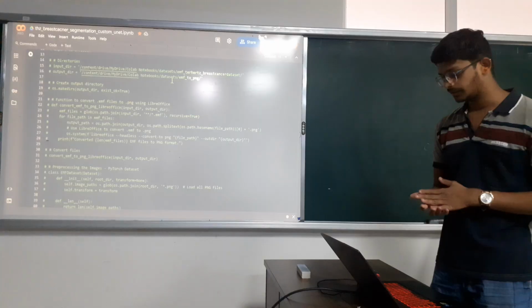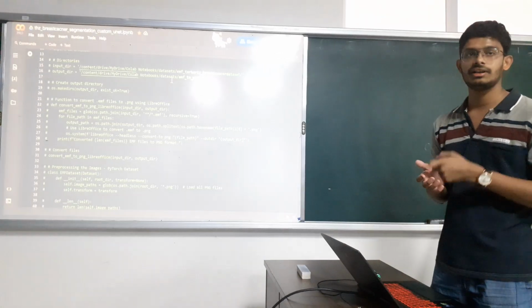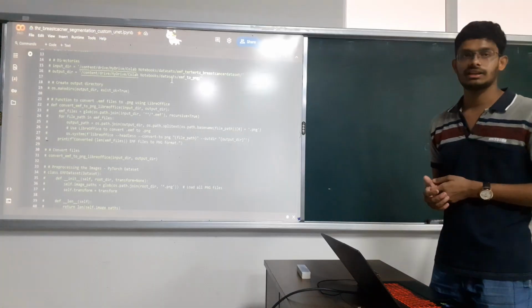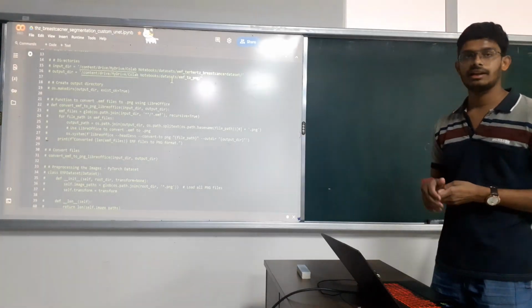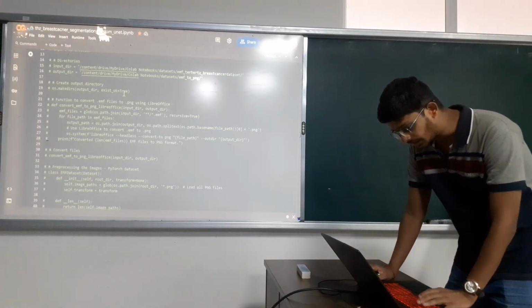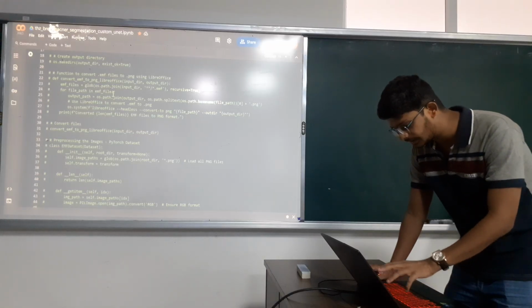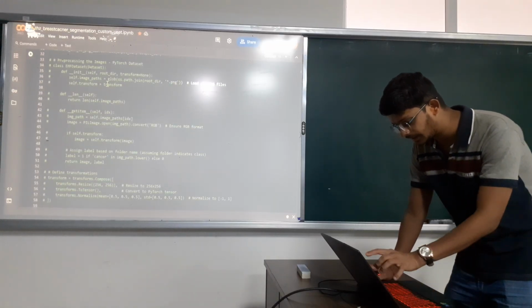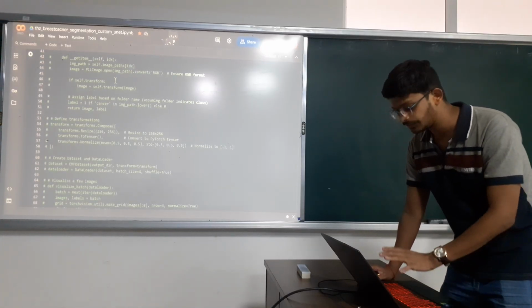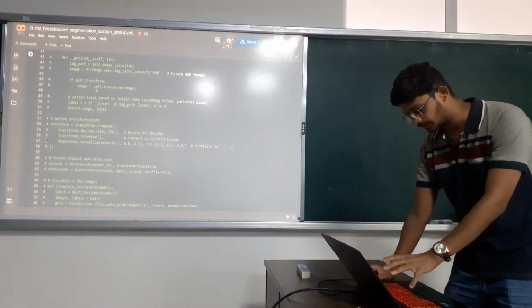So what we are basically doing here is taking the EMF images. The total number of images that I have here is 73, taken from hospitals in Hyderabad. Those 73 images are in EMF form, so first I need to convert EMF to PNG format. For this I am using the LibreOffice library, which has all the packages for converting EMF to PNG. Then I have created the init, length, and get item definitions and the transform from PyTorch, which does the following task for the cancer segmentation with labels inside this commented code.